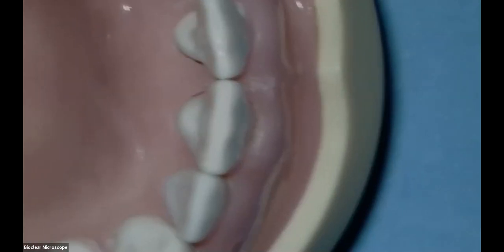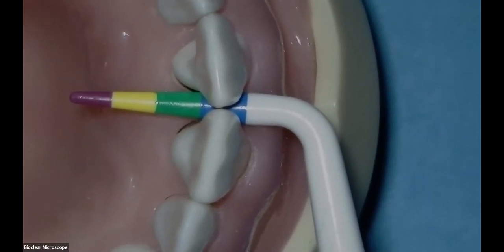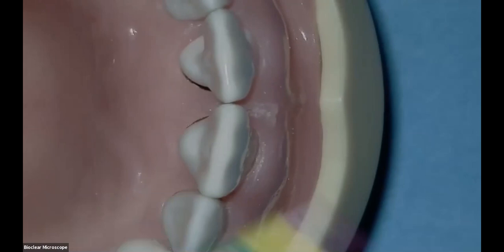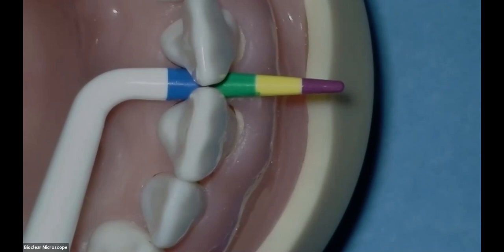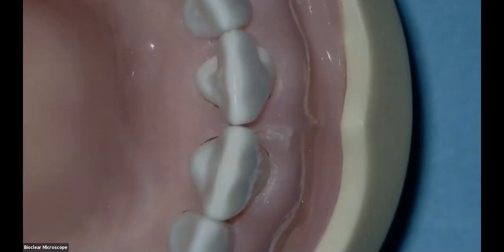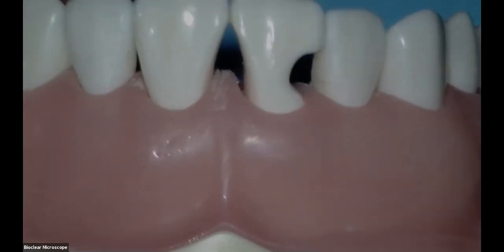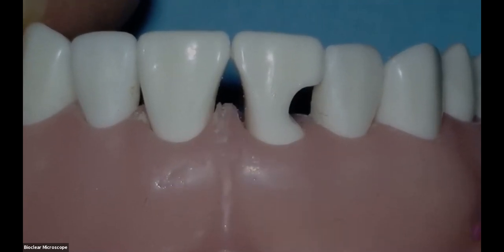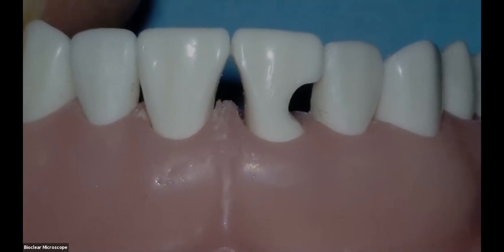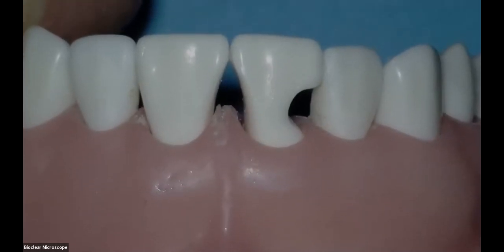So I'm going to come in here. I'm going to measure from the facial with the black triangle gauge, and that is binding at the blue. And then on the lingual, it's binding between blue and green. So then I would ask the patient what their preference was. I would say, for this black triangle, you're really sort of between sizes. Is it okay for me to leave a little black triangle or not? If I close the black triangle completely, the tooth will look a little bit more rectangular. Usually the patients say, make the black triangle go away.